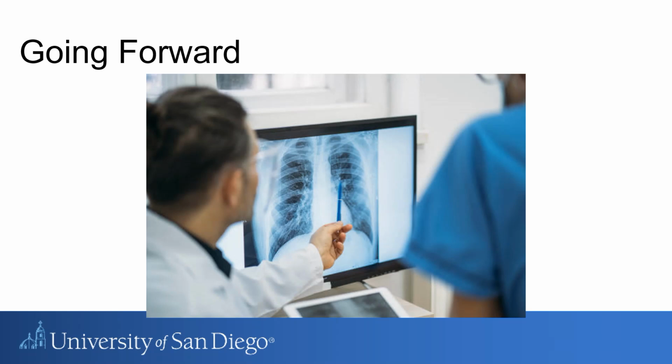Going forward, ultimately, our goal is to build a system that would flag subtle findings early, helping radiologists and other medical professionals focus their attention where it matters most. Experimenting with our CNN and our fine-tune, we would probably try combining these into a full hybrid model where EfficientNet initially identifies findings, and then a later CNN incorporates the tabular data. We would also evaluate generalizability on external datasets beyond the NIH to reduce dataset bias.